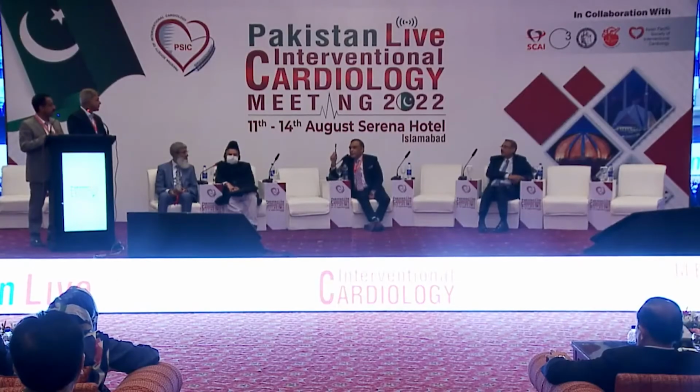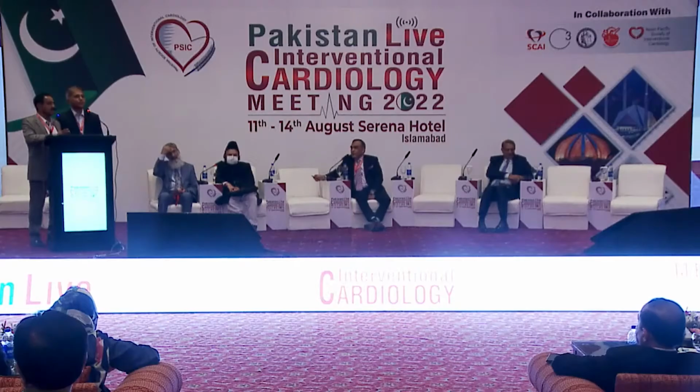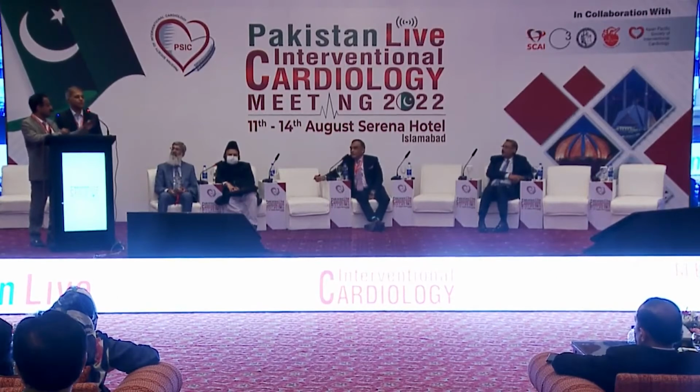By that debate, let me be a bit provocative. Then why do we do DK crush? It's been clearly shown, so why don't we just put a good stent in the side branch, crush it with another stent, and not do a final kiss? Why is the final kiss more important? Because of the metal within the ostium. The bench tests also show that if the ostium is fully open, it is much better in the long term. Then I can understand, but here there is no metal, just a few struts, and I know the cell is small, but there are other cells which are against the circumflex also. So it's not going through one cell, there are multiple cells. But again, that's one way of doing it, that's fine.